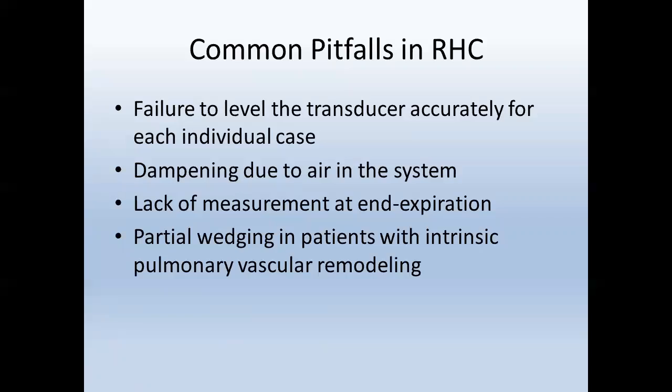And it's a simple thing, but it's a problem throughout the world. As a community, we have not been able to come up with standard guidelines because one hospital measures differently and another hospital measures differently. So the pulmonary hypertension and heart failure community has now standardized this, and you have to do it at the mid-chest level, which is like 5 centimeters below your sternal margin.